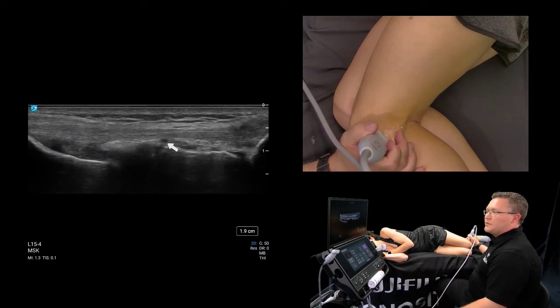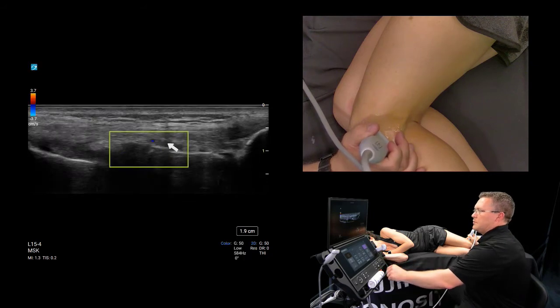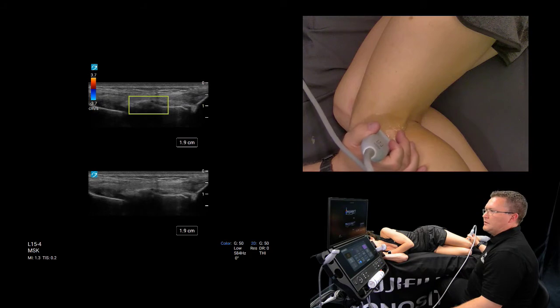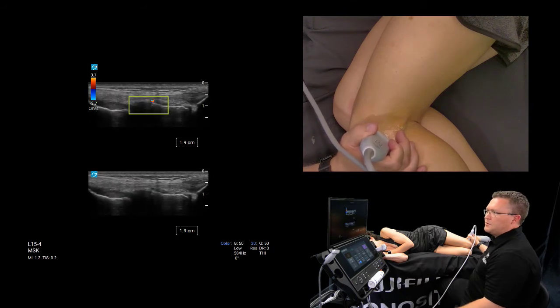And if you are using the Sonosite PX or the newly launched LX, this is a good time to show that you can be doing those procedures simultaneously with a top-bottom feature and driving your needle without that color artifact flashing, and get your needle right up near the neurovascular structures that you might be doing a procedure around.